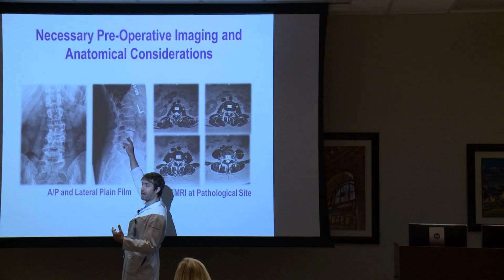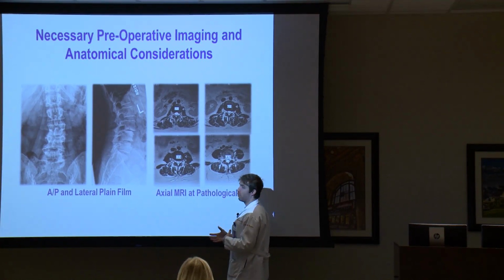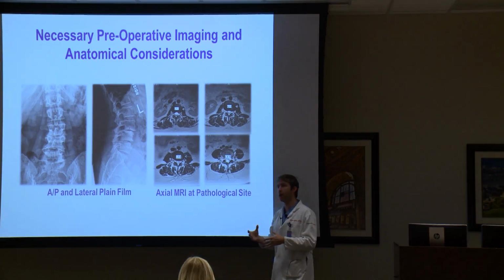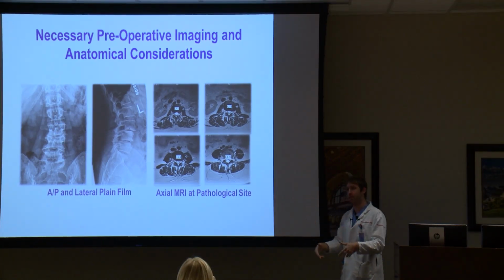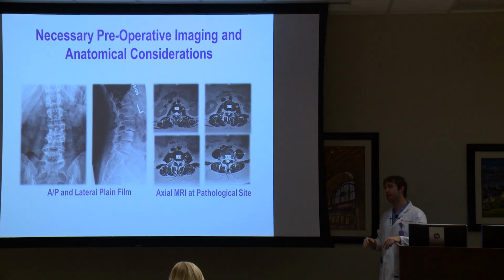They have this adjacent segment disease, that level above. Well, boom, perfect, right? I don't have to put in more screws and take up his fusion before and do all kinds of takedown of structures in the back to find where his screws are. I can put a lateral in just above it and hopefully get all the things that I wanted from it. So you take that fusion up a level.